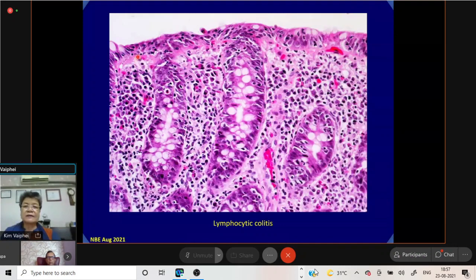And so this is a colonic biopsy where one could see many lymphocytes. Scattered eosinophils are there definitely, but this is mainly lymphocytes. And also see the number of the goblet cells has reduced grossly. We were seeing the goblet cells in the first, that normal biopsy. So there is mucodepletion, there is gross increase in intraepithelial lymphocytes, more on the surface and also towards the crypts.